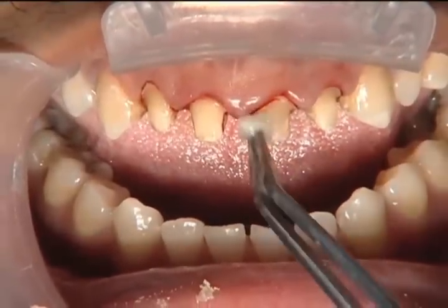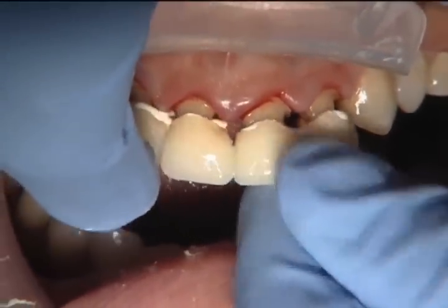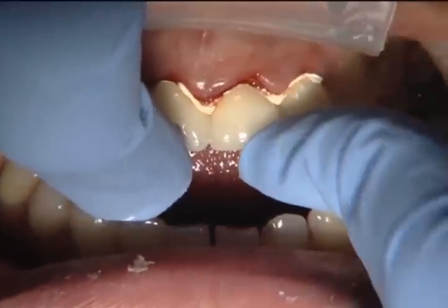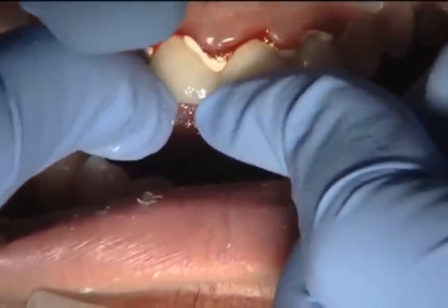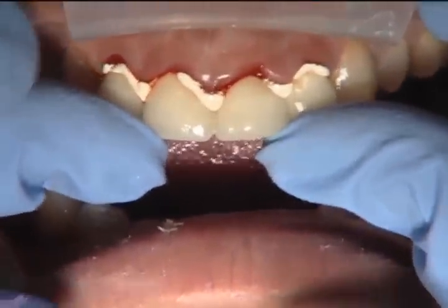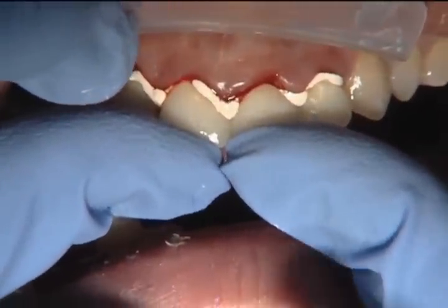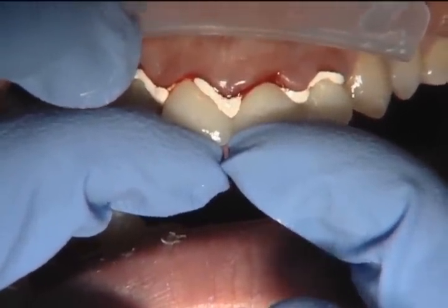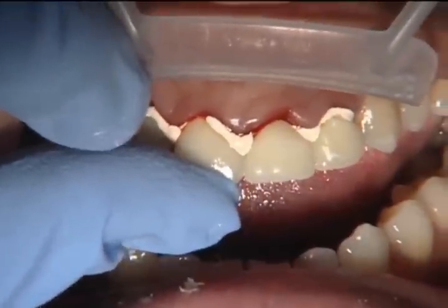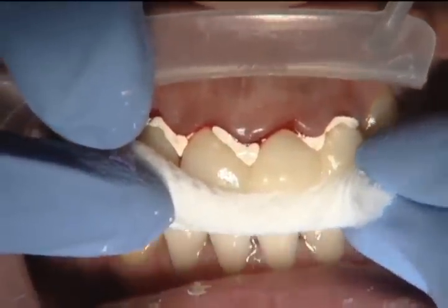Now that we've taken the impression, we're putting the exact same temporaries back in place with no adjustments, because we know the tissue is going to be in the same position it was at this appointment. You don't want to make any adjustments to the gingival levels on your temporary when you impress on that second visit. We put the BioTemps back in with some Temp Bond, let it set, and clean up the Temp Bond from around the margins.